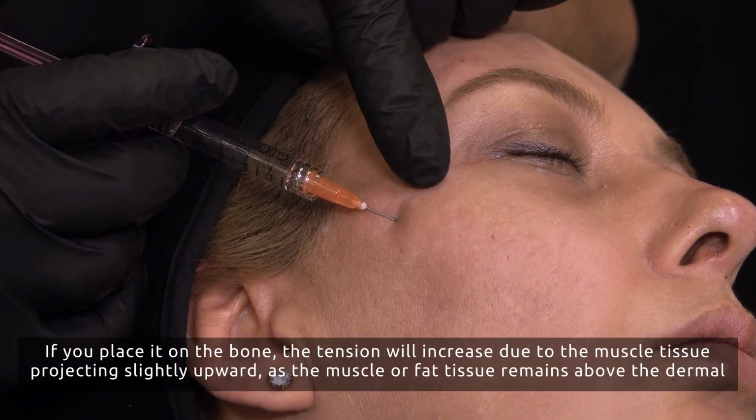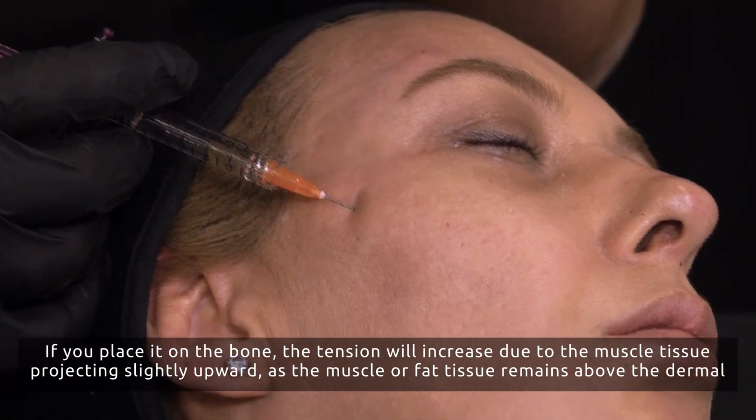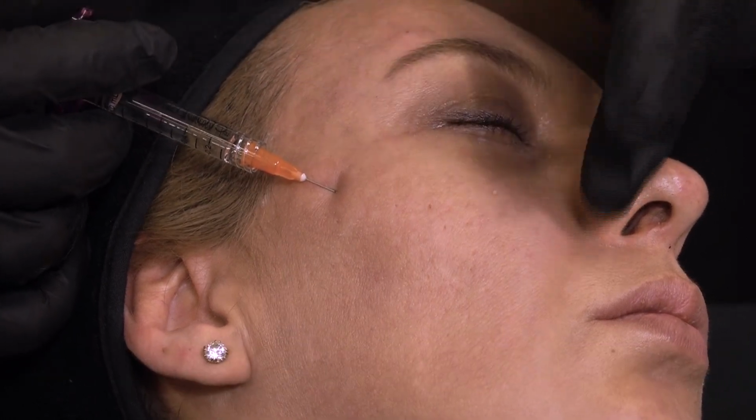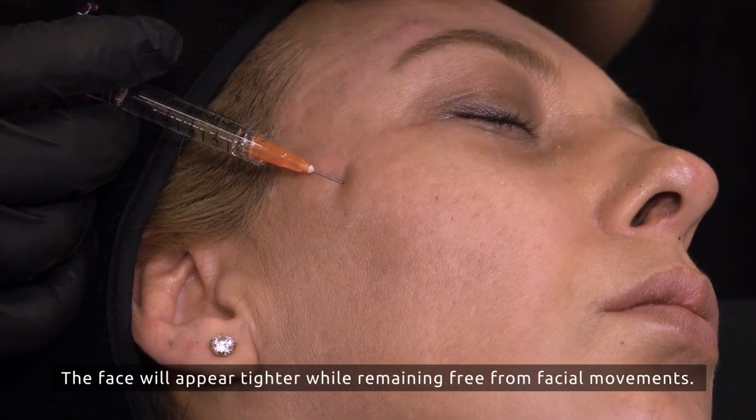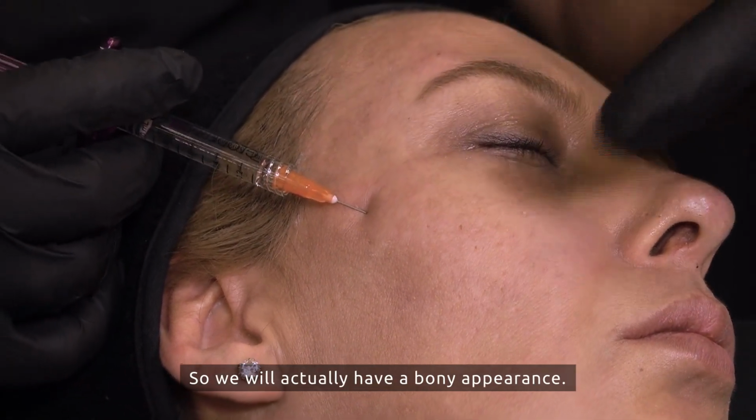If you place it on the bone, the tension will increase due to the muscle tissue projecting slightly upward, as the muscle or fat tissue remains above the dermal filler. The face will appear tighter while remaining free from facial movements. So we will actually have a bony appearance.